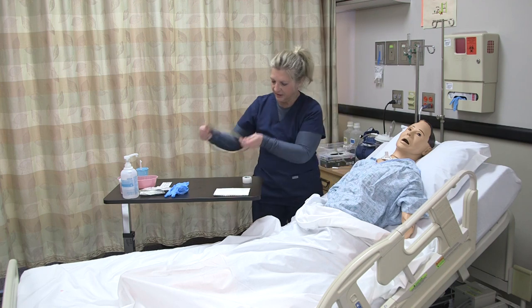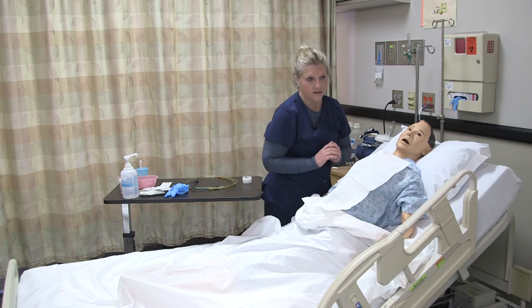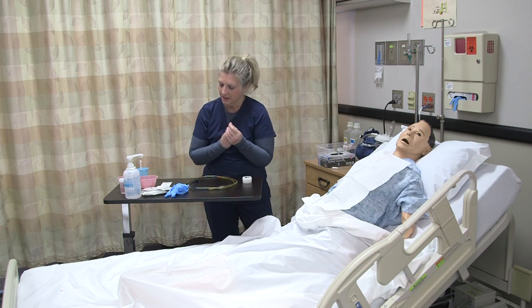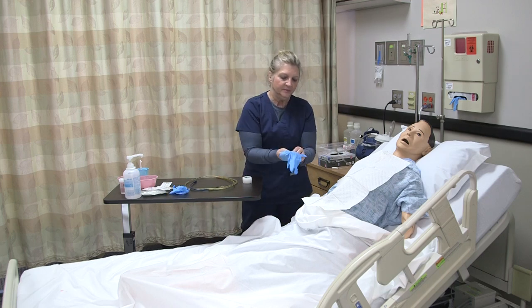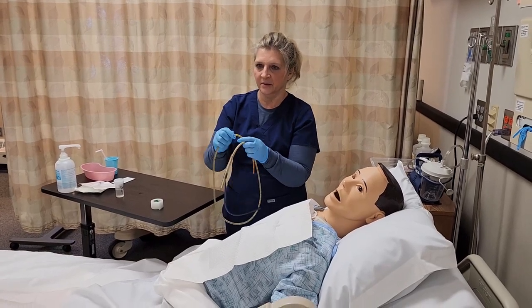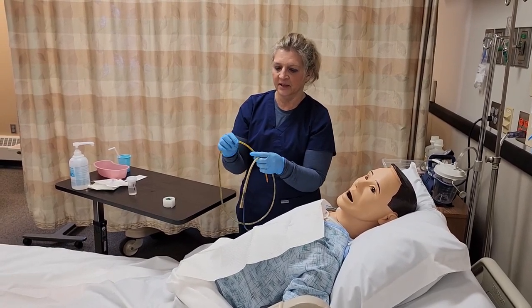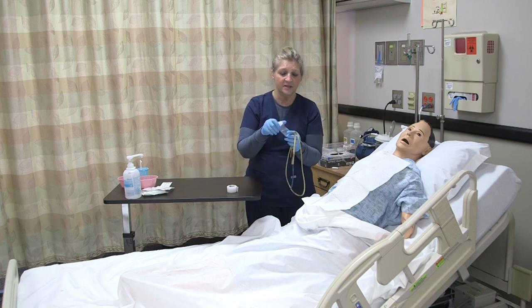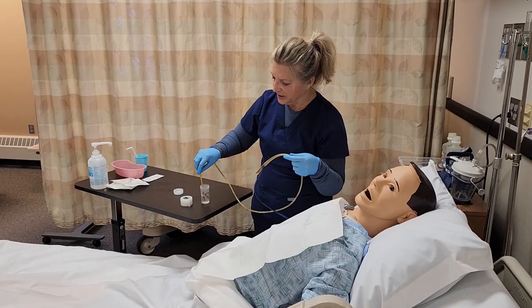Once I have that determined, I'm going to go ahead and put a non-permeable towel on my patient's chest, just in case any secretions get on there. I'm going to wash my hands and put on gloves. Now I'm ready to insert the NG tube. If the tube feels stiff, you can warm it with some warm water to loosen it up — you don't want it too loose, but perhaps semi-loose. We'll use water-soluble lubricant on the end so it can pass easier, and I'll go ahead and apply the lubricant.